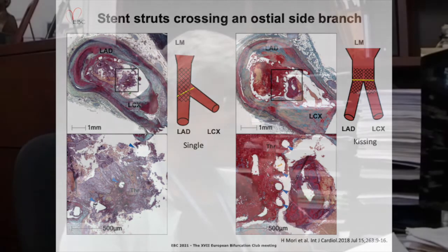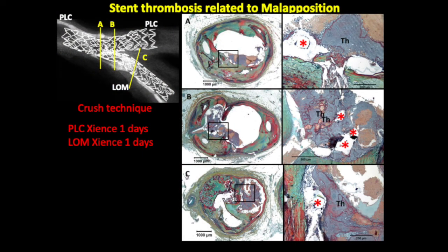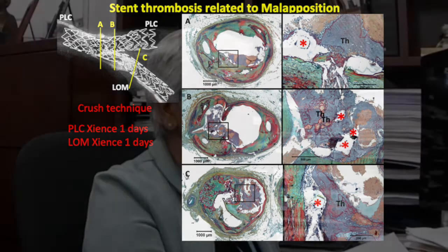Here is an example of a crush technique that led to stent thrombosis purely because of malapposition. The struts are shown in red — you can see they are malapposed. There is an underlying plaque, and you can see malapposed struts and luminal thrombus. Malapposition occurred during crush stenting.